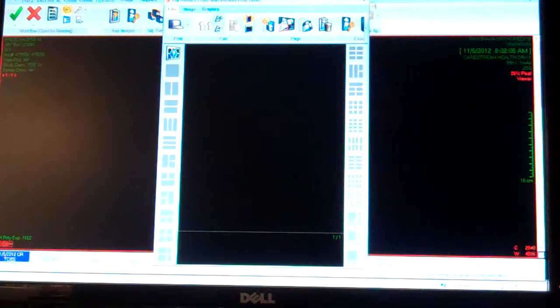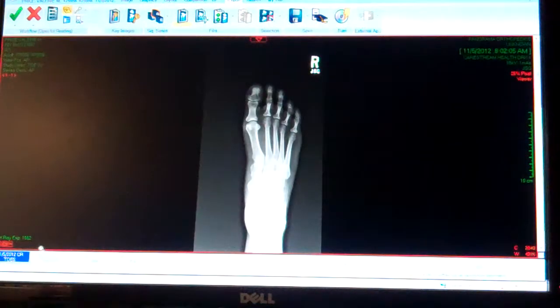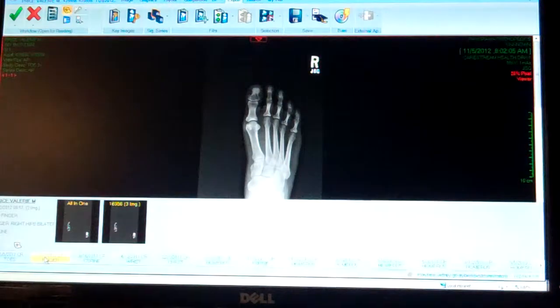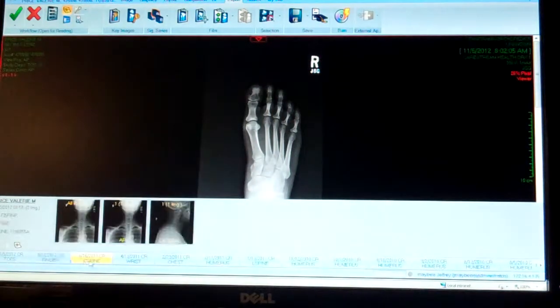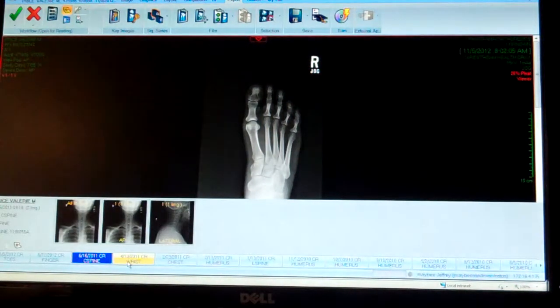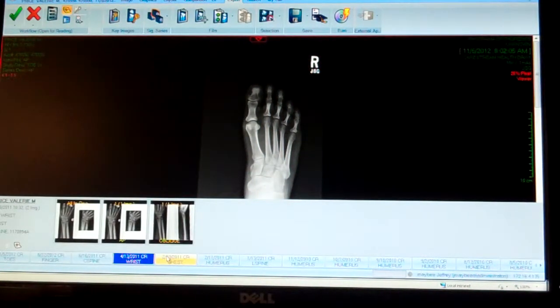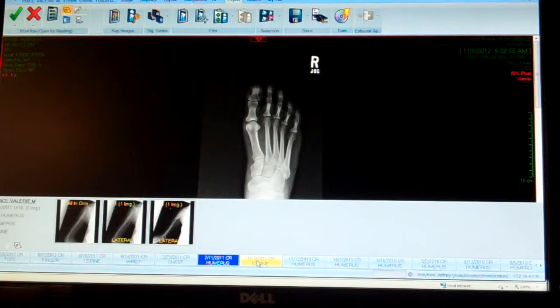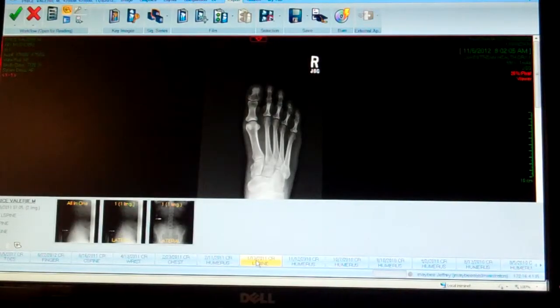Those images are located on the bottom of the screen here on the Strip Mini Archive Explorer. Every exam that the patient has had done is listed down here.